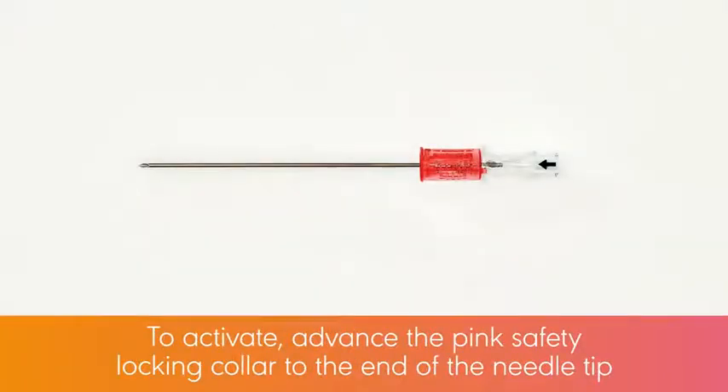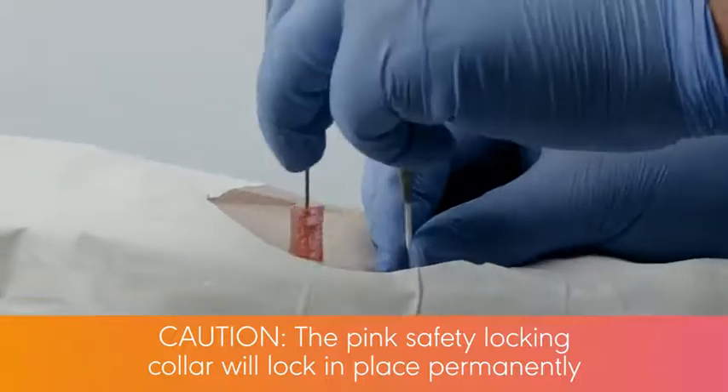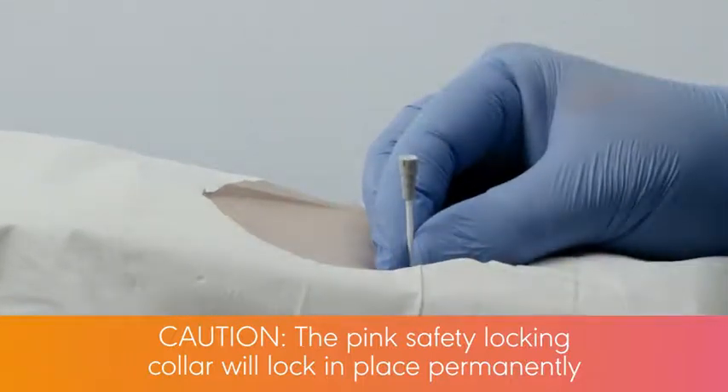To activate the Introducer Needle safety mechanism, advance the Pink Safety Locking Collar to the end of the needle tip. The Pink Safety Locking Collar will lock in place permanently.